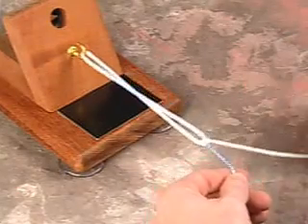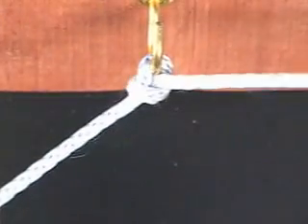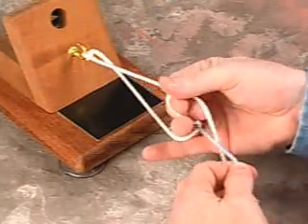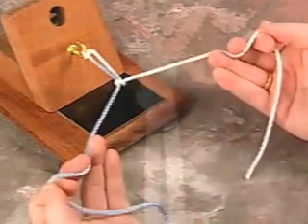An initial underhand throw is done, and putting even tension on both limbs, this is pulled into the joint. You then do another underhand throw, and this is advanced down into the joint.